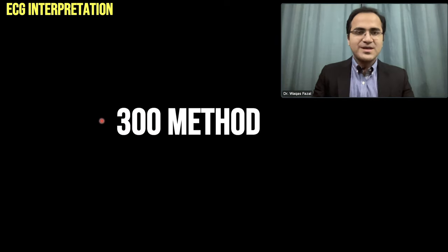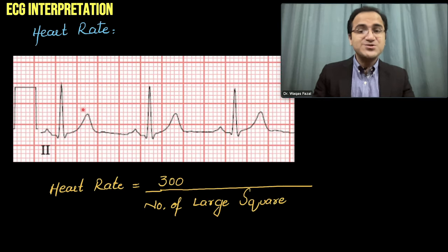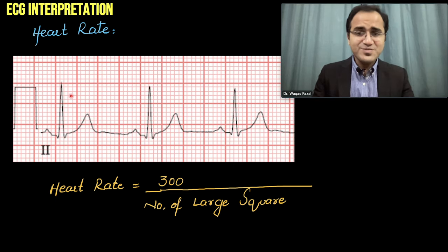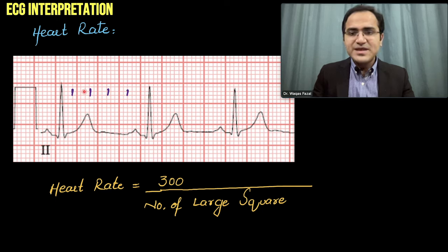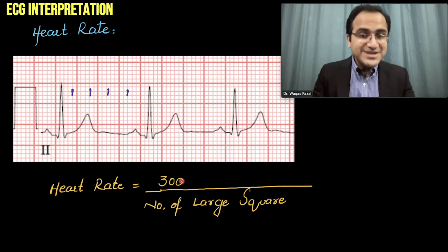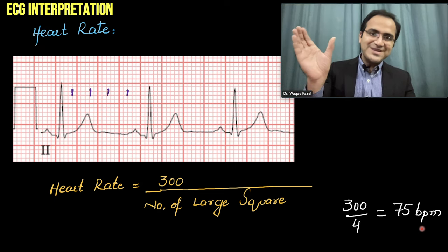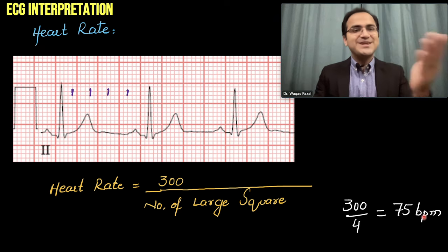The second method of rate calculation is the 300 method. Between the QRS complexes, count the number of large squares and divide 300 by that number. Using a calculator: the large boxes between these two QRS complexes total approximately four. 300 divided by 4 equals 75 beats per minute — the same result as the square counting method.